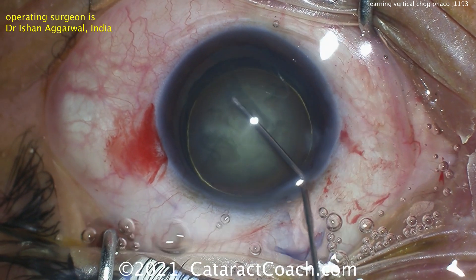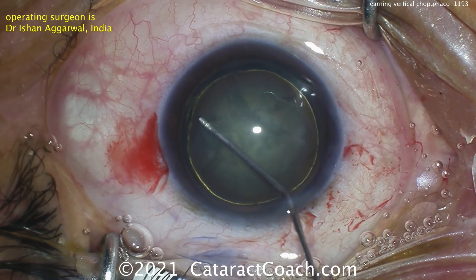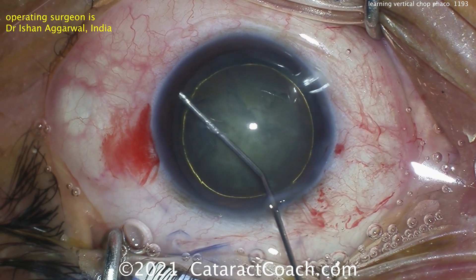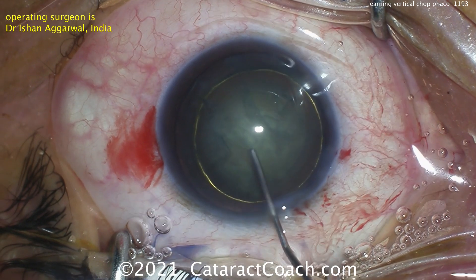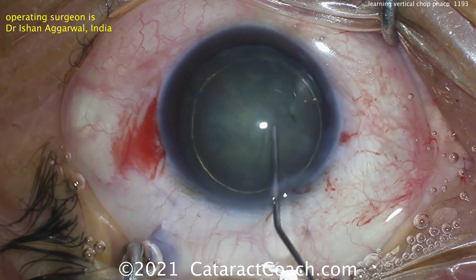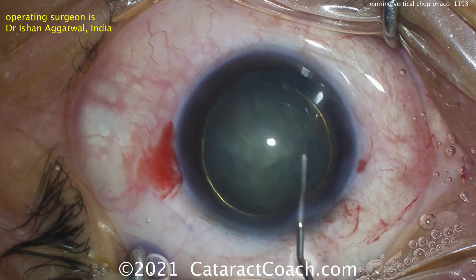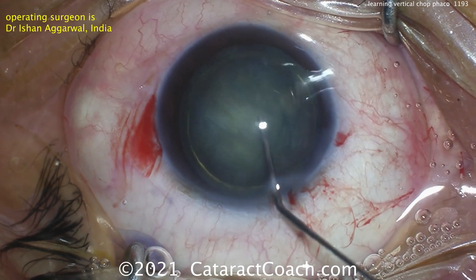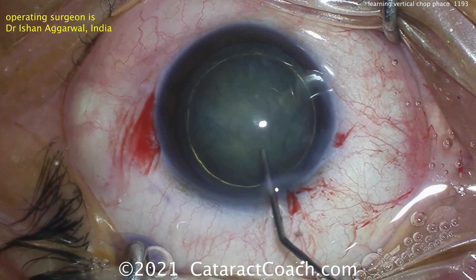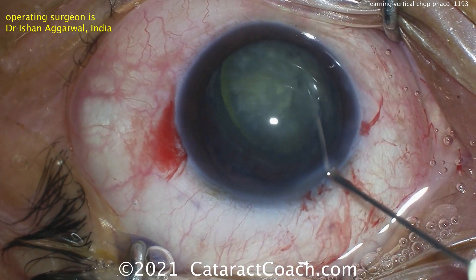Here's the case. You can see the hydrodissection being done — a good amount of nuclear density there. Vertical chop is significantly easier if the patient has at least 3-plus nuclear sclerosis. If the lens is very soft, like 1-plus NS, it's actually difficult to accomplish that. So this is a decent amount of nuclear sclerosis. You can see hydrodissection is done. The golden ring of hydrodelineation is present, and the nucleus definitely spins, so that looks great.